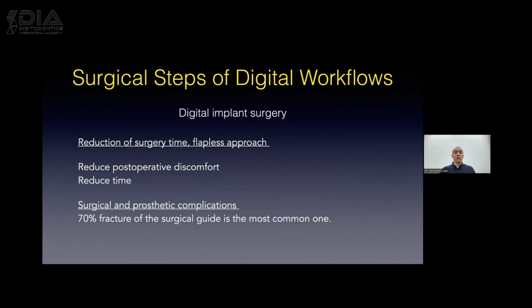Okay, so why are we using digital implant surgery? It's relatively easy. It doesn't need many skills. You just place the surgical guide and then drill through the sleeves and screw in the implant. You don't need to make a huge surgical field. You don't have to open big flaps. It will reduce the surgery time. And as I mentioned, it is a flapless approach. It reduces the post-operative discomfort for the patient.